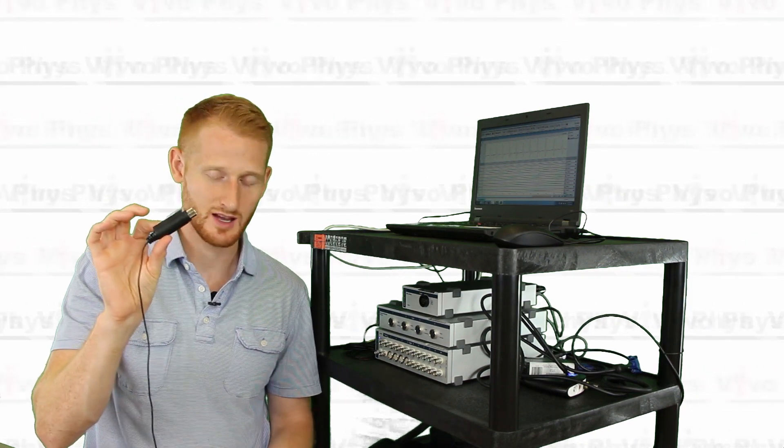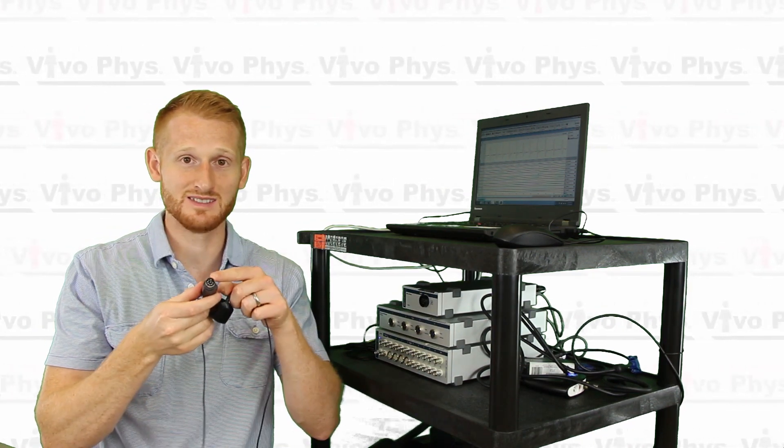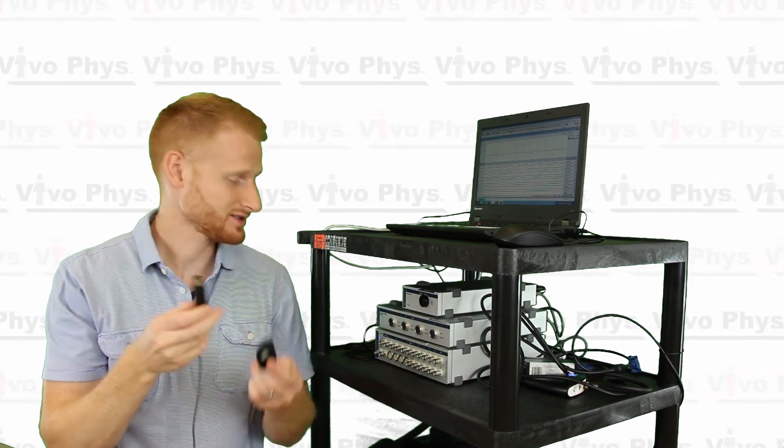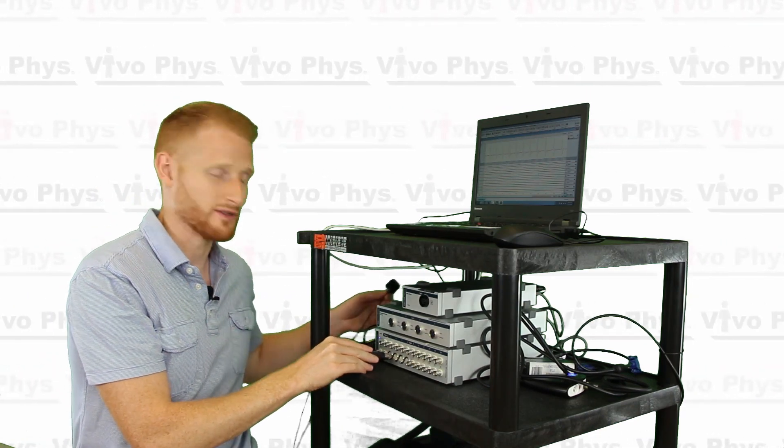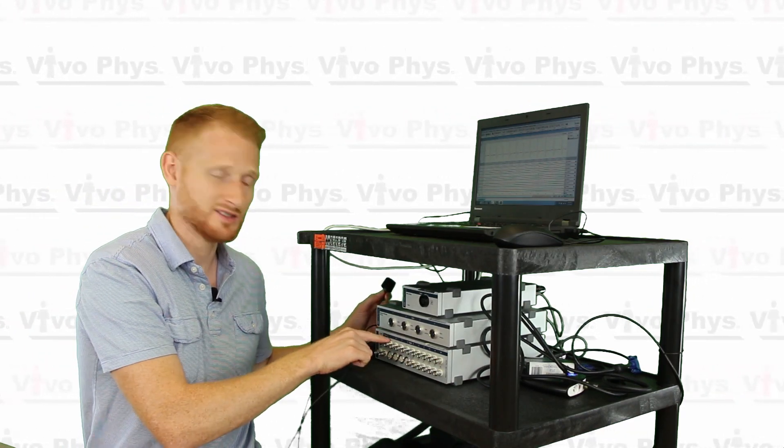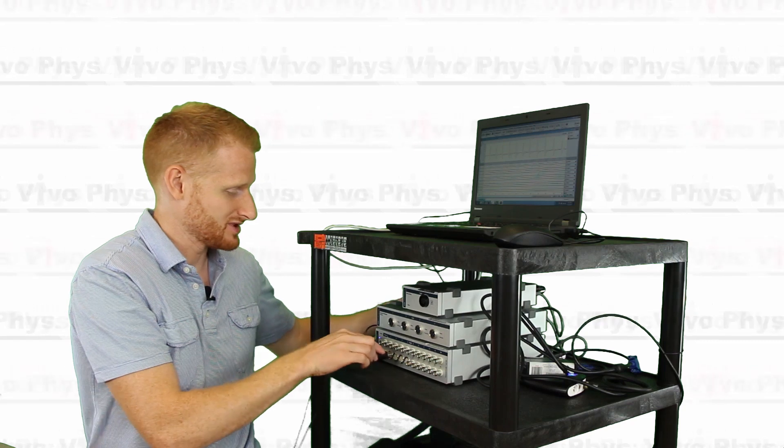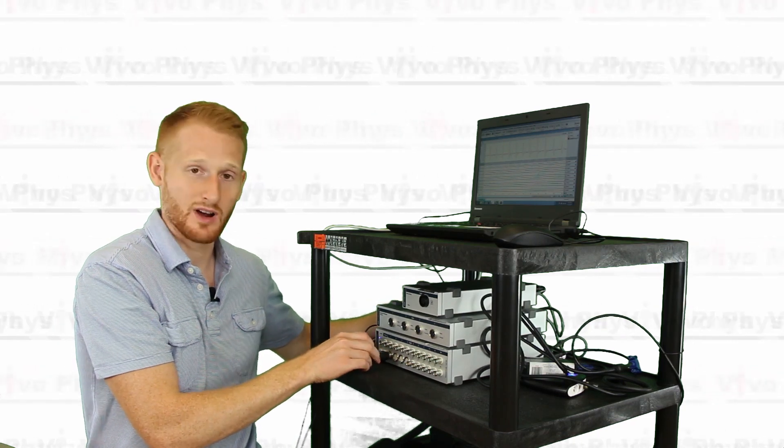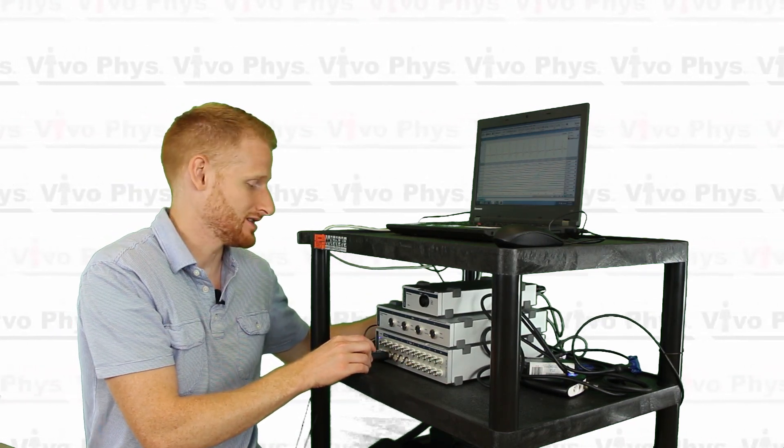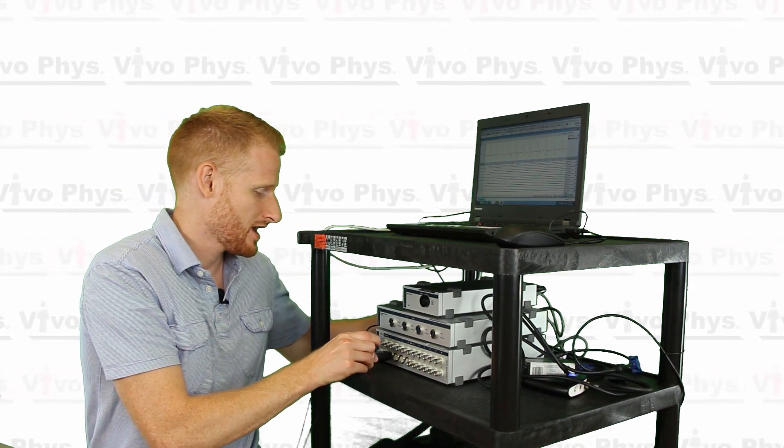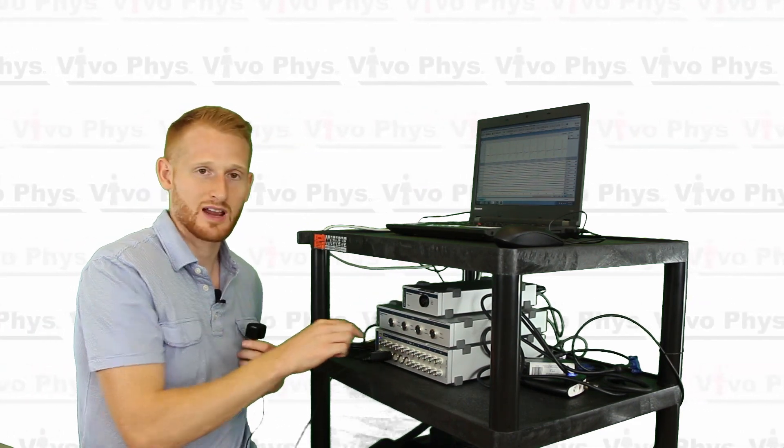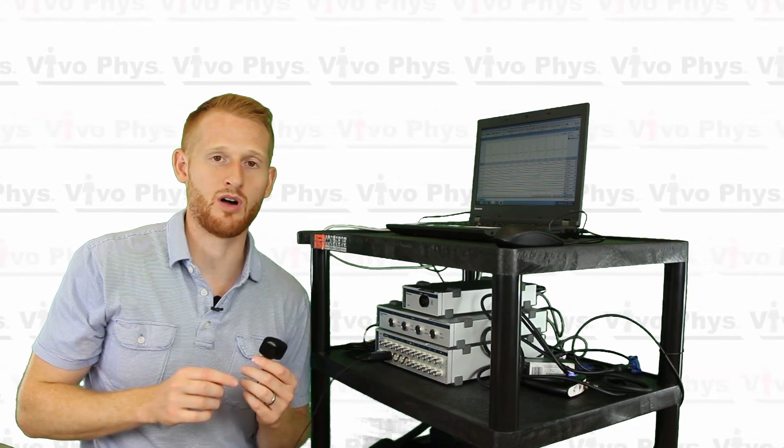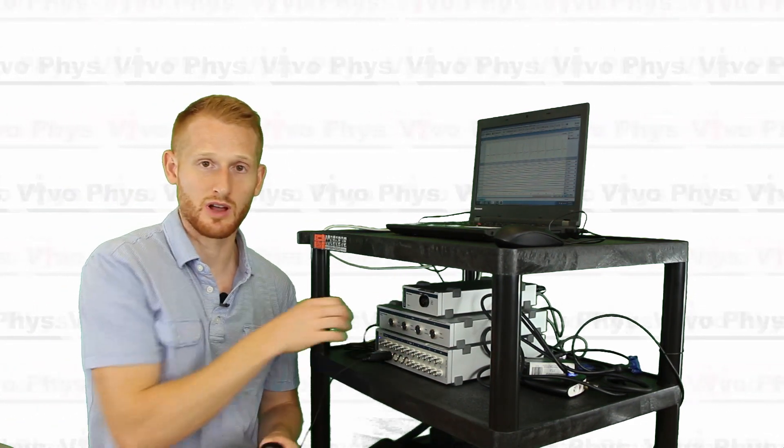If you take this, which is a DIN pin connector, and plug it into whatever channel you want—I'm going to plug it into channel one here because that's where I'm expecting to see it in the PowerLab software—you'll get a little green light that lights up on the plug when you plug it in.